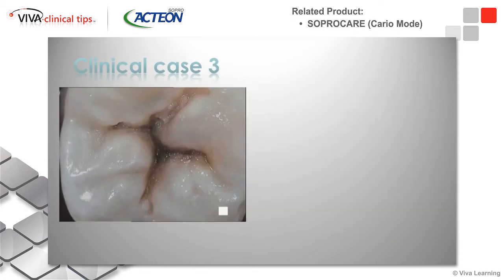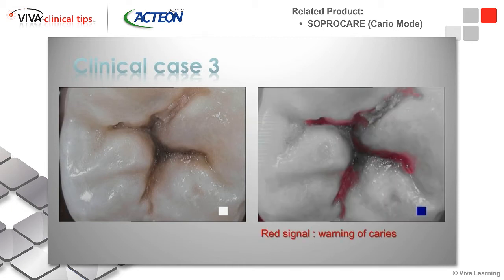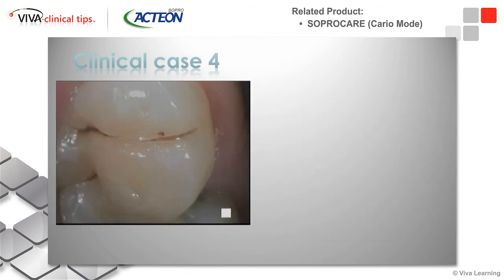Clinical case number 3, this is really obvious, even without the technology, but if you go even further, you can see the varying degrees. In other words, here it's red, but when you get into black, that's almost how I describe this to my patients: when you see black, that means the doctor could pick up the Explorer like we would traditionally do, and he can actually get a stick there. The other areas are really where it has extended, where we need the technology to actually see to extend the prep a little bit more.